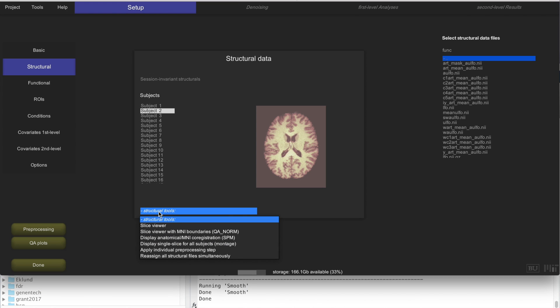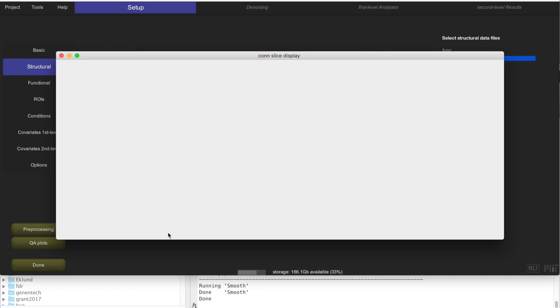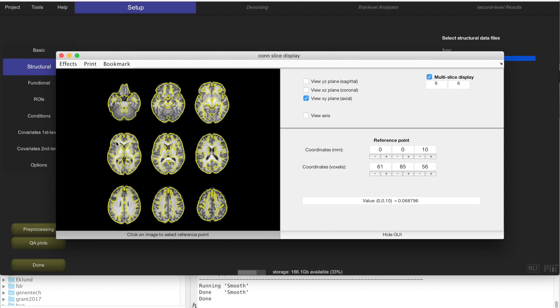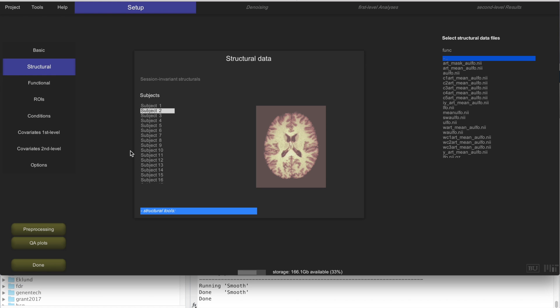You can also select a slice viewer with MNI boundaries to display for an individual subject the MNI boundaries and how they look with respect to the actual structural data. That should give you a very good match between those boundaries on the template and the actual structural data for that subject after normalization. So this is both the structural and functional data normalized.